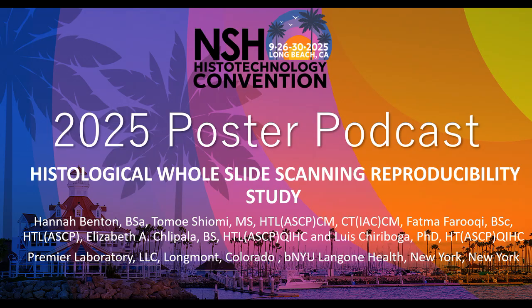We do. What Louis provided me is what he was scanning at his institution. We thought we needed to do that across multiple institutions. So we created a new control block that had a few cores in it. I sectioned it and stained it, so we have 2 serial sections.